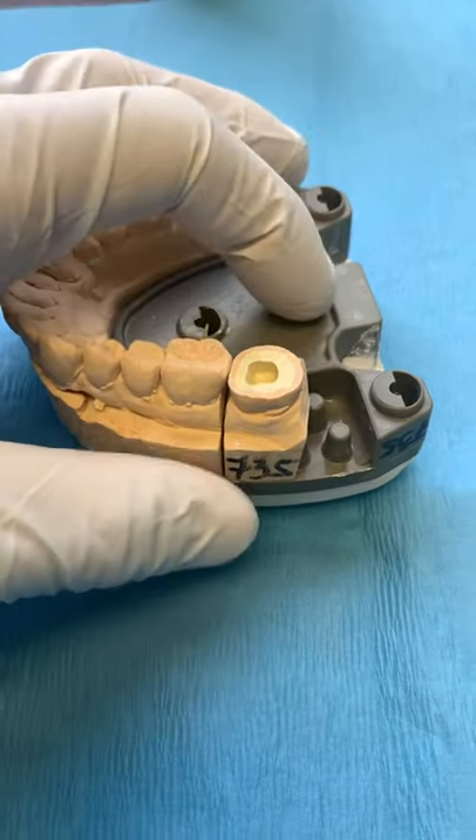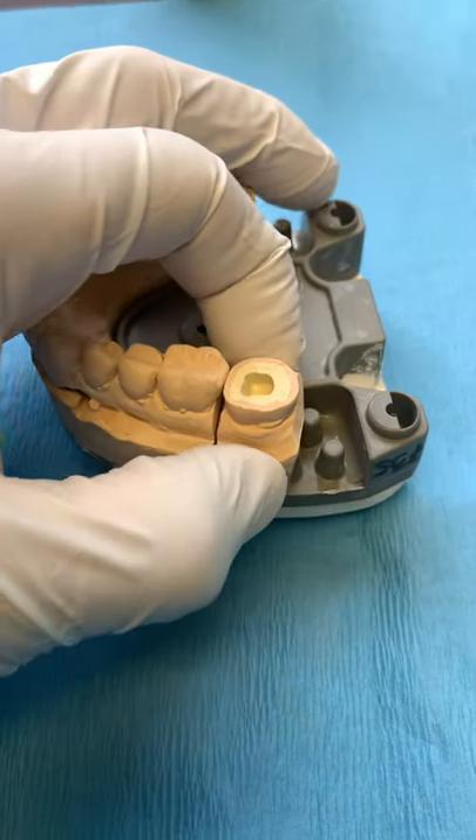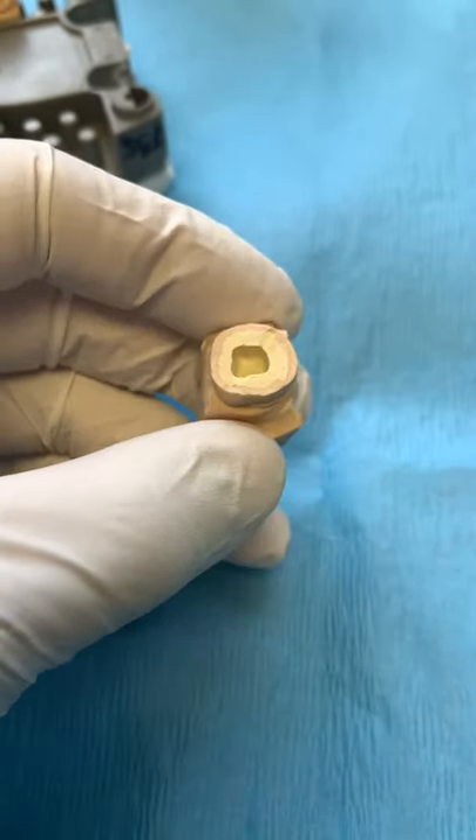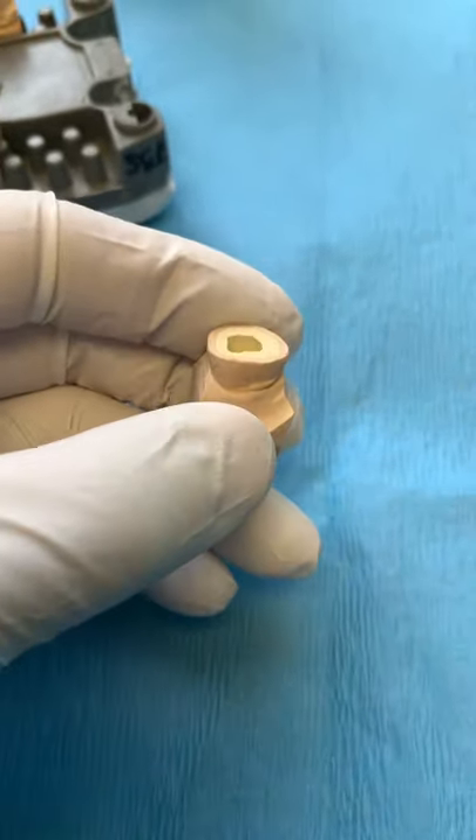This is a 3-6. And this is an endocrown. So what we did is, when we referred the case back to the initial provider, we elected to do an endocrown.